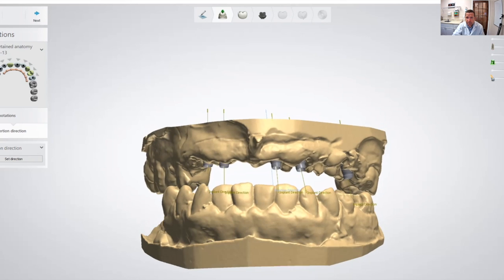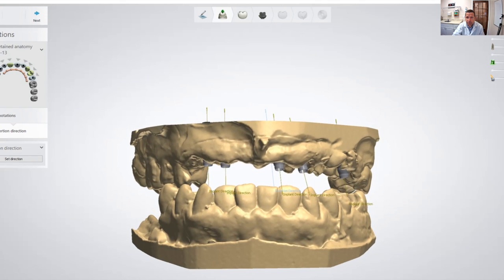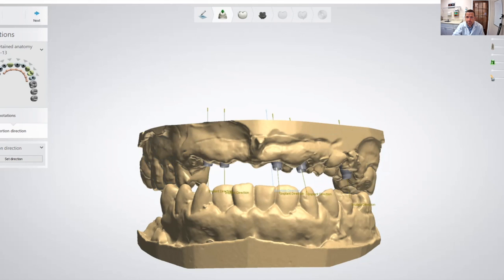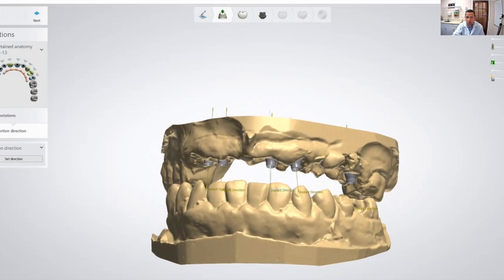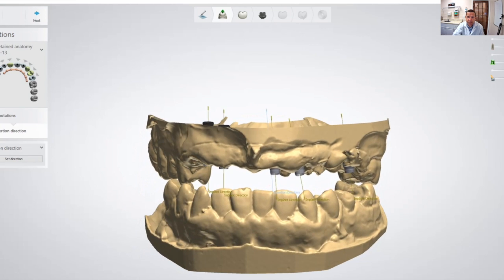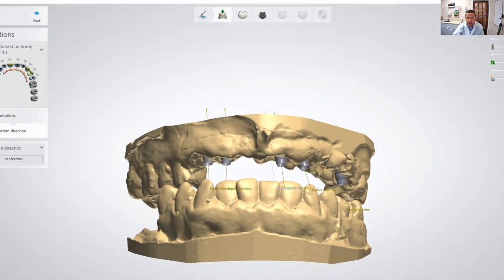I took the teeth out this morning. I placed the implants, I took the impression, I made a temporary for him, which I already have scanned as a pre-op, and took the impression, took the bite, and the patient went home with a temporary. And on Monday, today is Saturday, on Monday I'm going to bring him back to place the temporary bridge made of permanent material, made of zirconia.